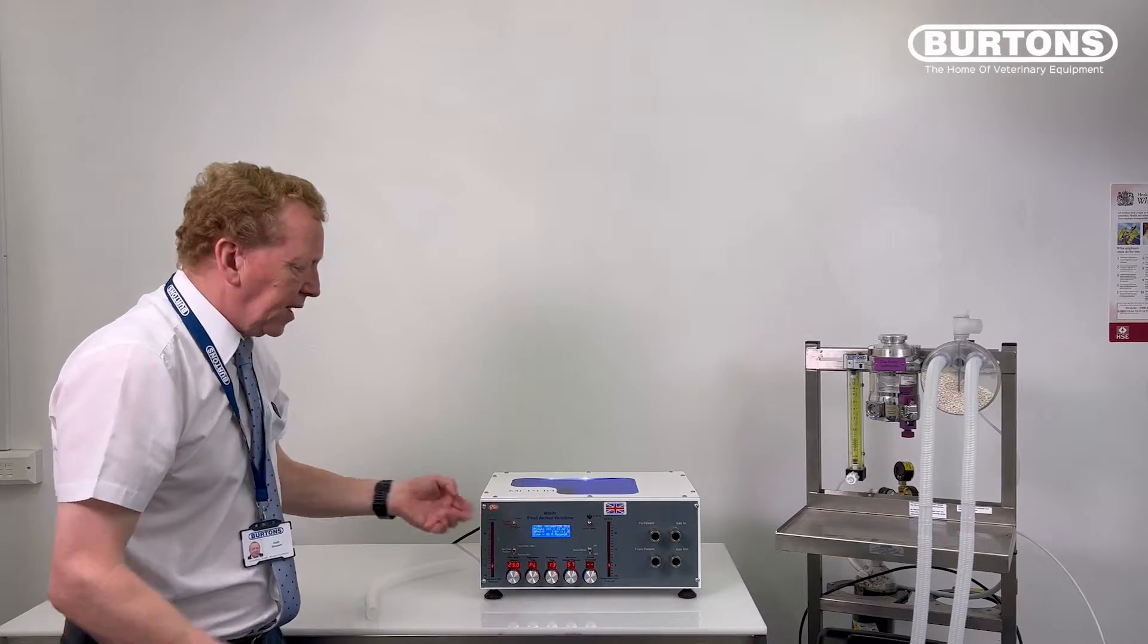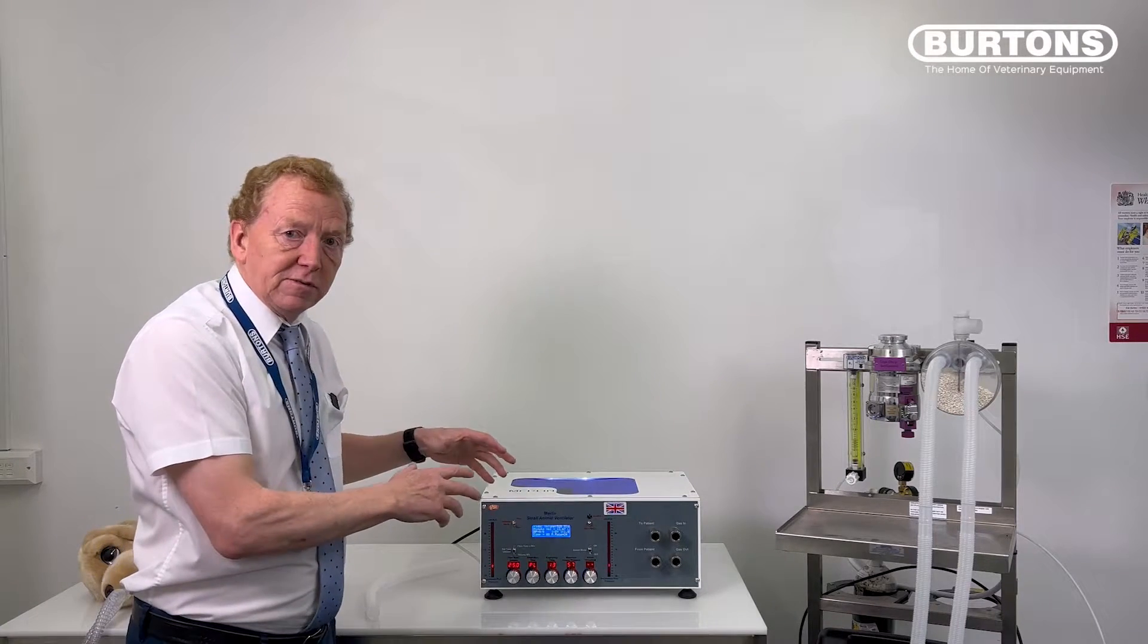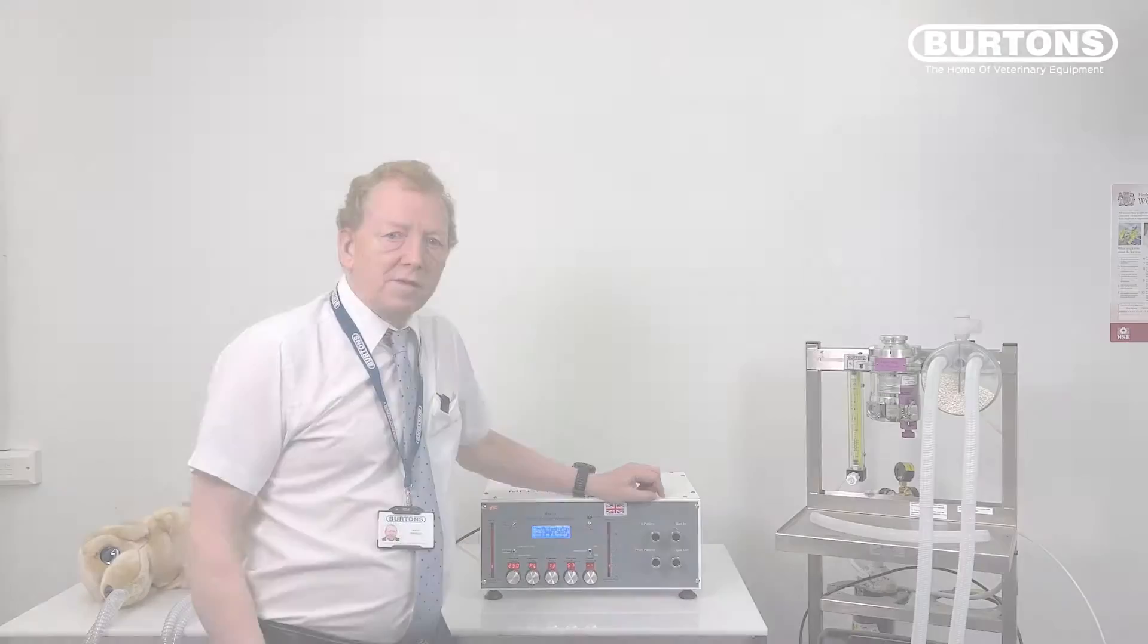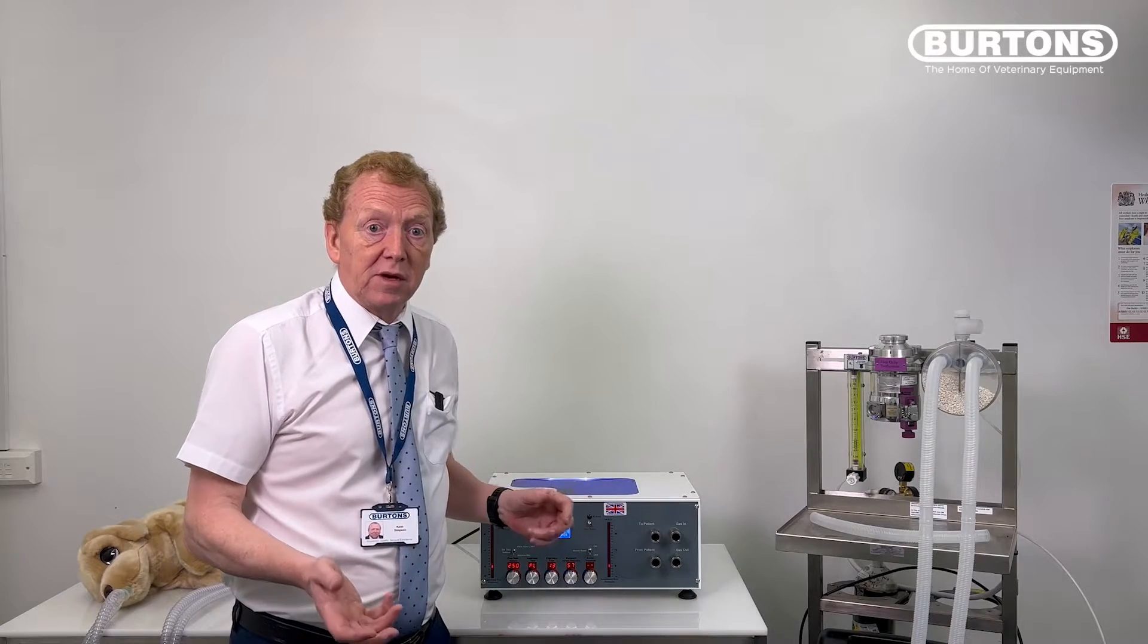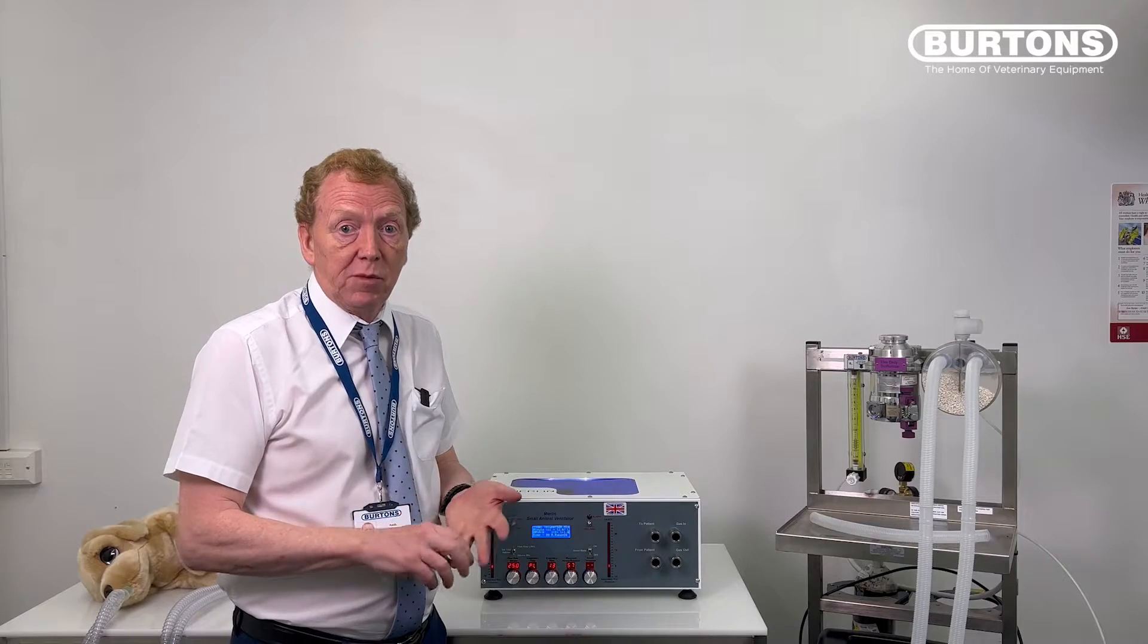So there we are. This machine is performing perfectly, so I now know that I'm ready to use the machine. It's got no leaks and performance at a level where I'm happy with it. The second part of your Merlin setup is now going to be the plumbing. We're going to set it up for non-rebreathing and a rebreathing system.